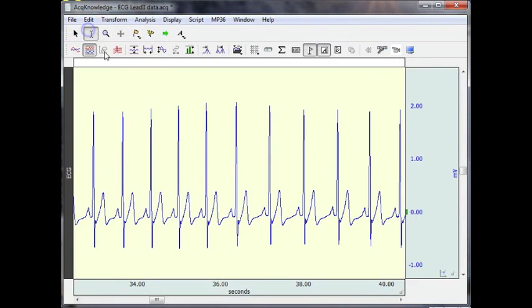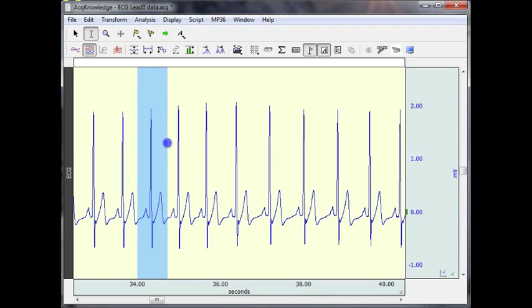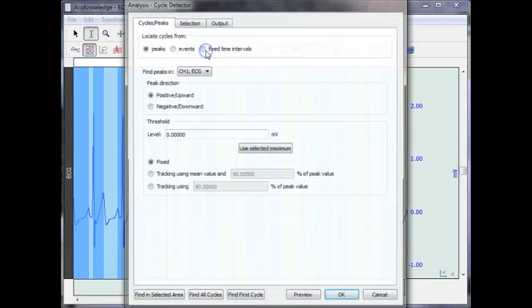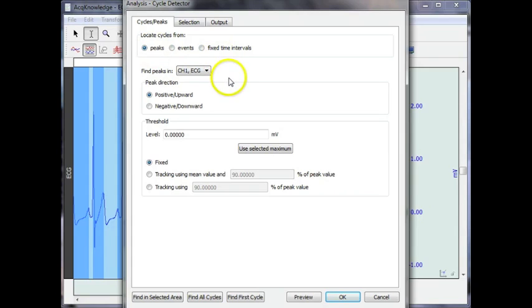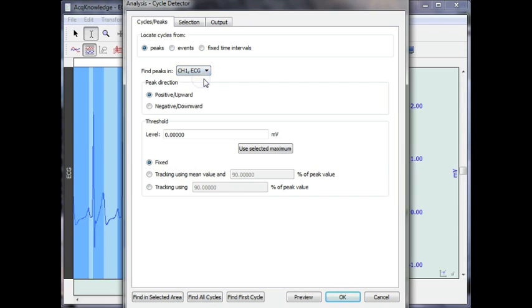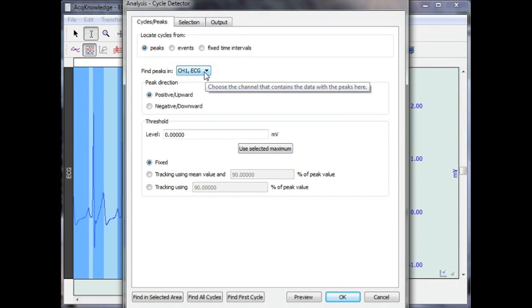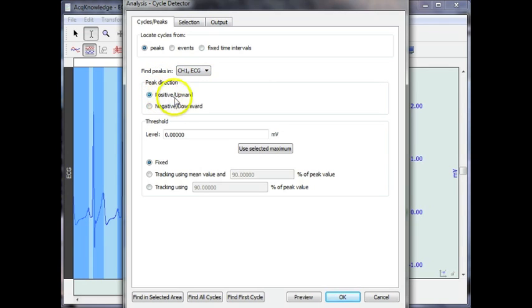So I'm going to back up a little bit to make it easier. Highlight one typical cycle. Go back into my menu and I'm going to locate a peak within my data file. I've only got one channel of data, which is the ECG.